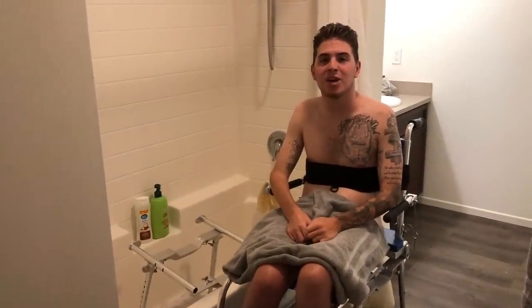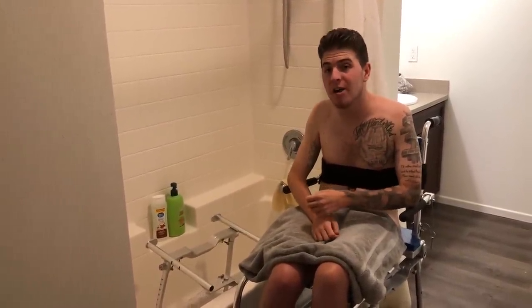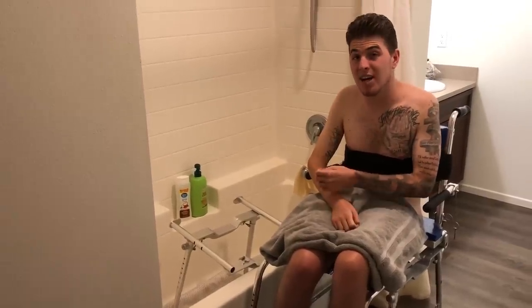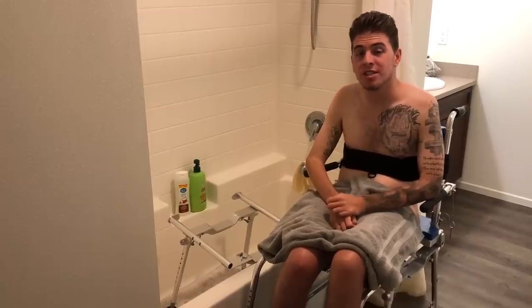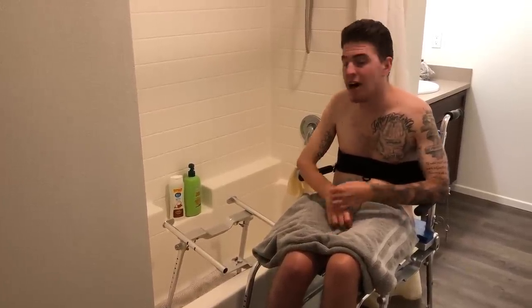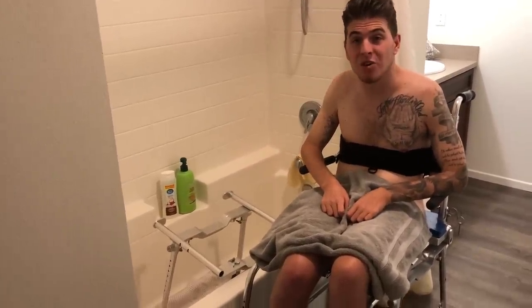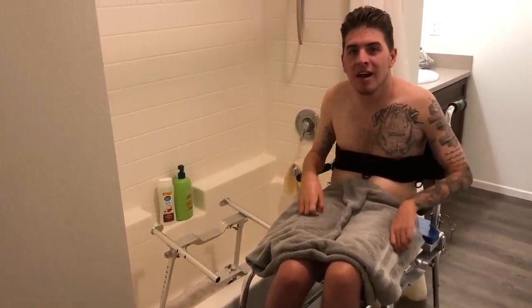Hey guys, this morning I wanted to make a quick video showing you all how I actually shower over a tub. I recently moved into my apartment full-time and unfortunately they only have a tub — I roll and shower, which is what I had at my parents' house. So I purchased this commode chair from Go Mobility Solutions and it actually allows me to slide over into the tub and shower in it. I'm gonna have my girlfriend come and put it together and then show you how I transfer into the tub.